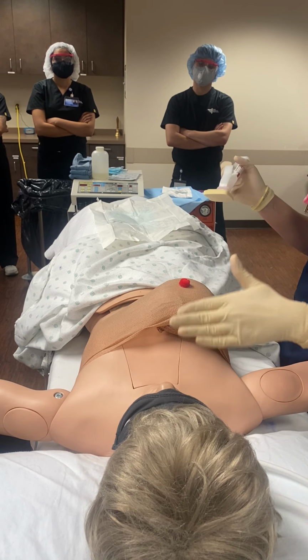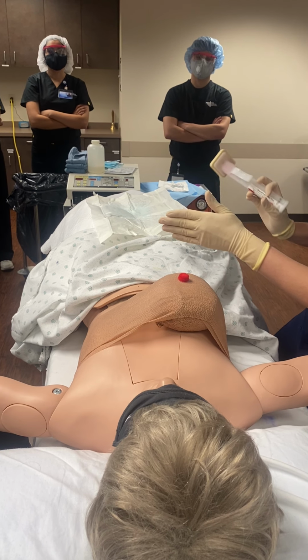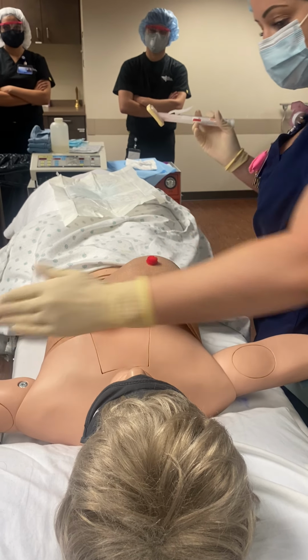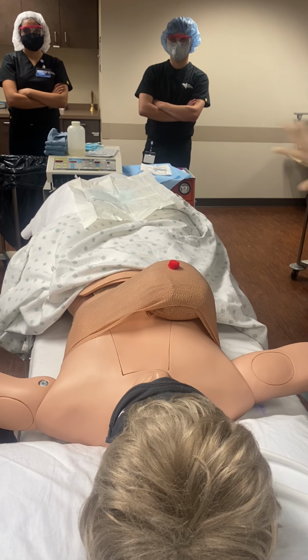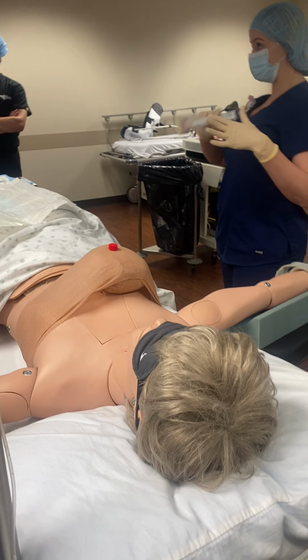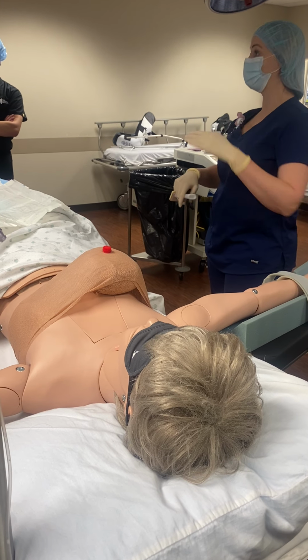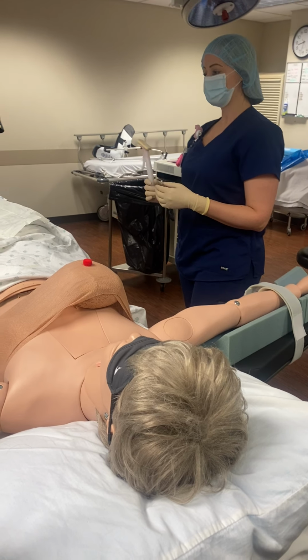Then we'll go from chin to about mid rib level, and then right down to the armpit sides, like right here. So that would be the area that would be prepped out. For our uniboob, that's kind of how it is. If you were just doing one breast, it'd be midline to armpit, so almost to the belly button, and then to chin. So that would be the prep. And then we let it dry.